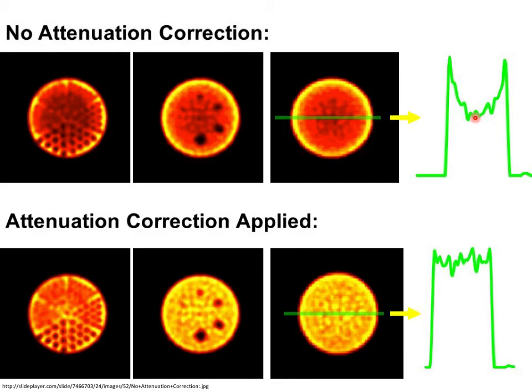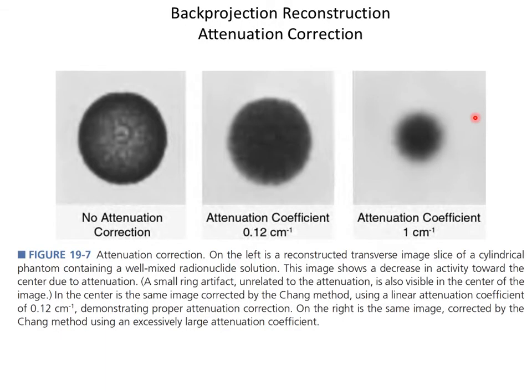So you need a picture, a CT picture of a large field of view to determine how to correct for these perfusion deficits, or the reduction in signal intensity due to the absorption or the attenuation of the photons by the patient themselves. And it's a big deal. It's the primary reason why people are called false positive. It's because you get dark spots that are incorrectly labeled as perfusion deficits when they're really an attenuation.